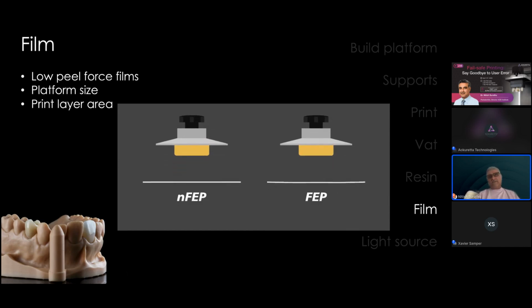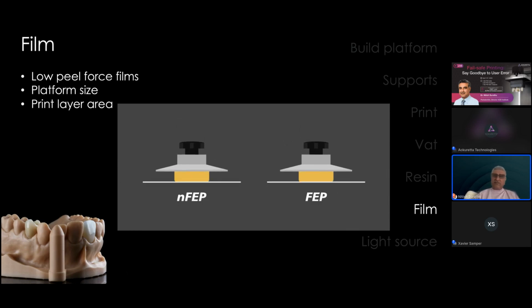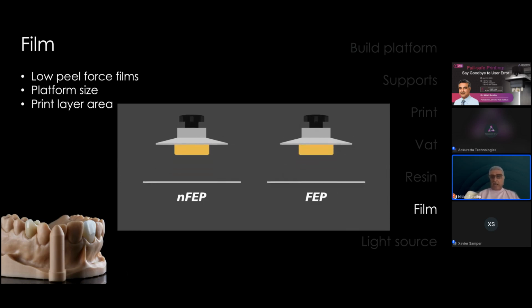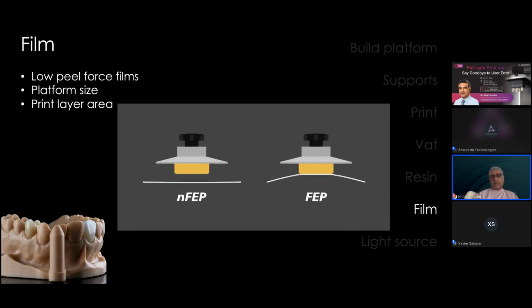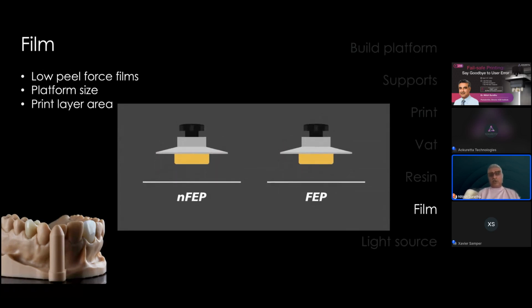Now, you will find YouTube videos talking to you about changing films. You will find that NFEP films are available on the market. And I have changed NFEP films myself on some of my vats, but I wouldn't suggest you do that unless you know what you're doing, because it can lead to a very expensive problem, which I'm going to show you on the next slide.